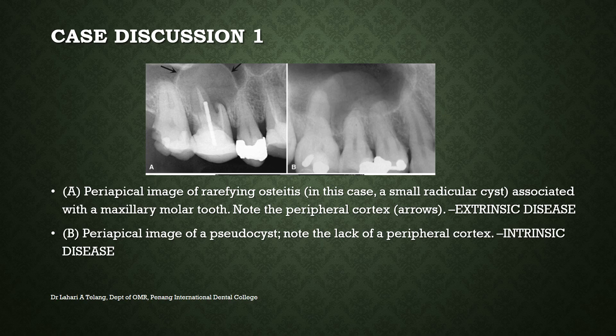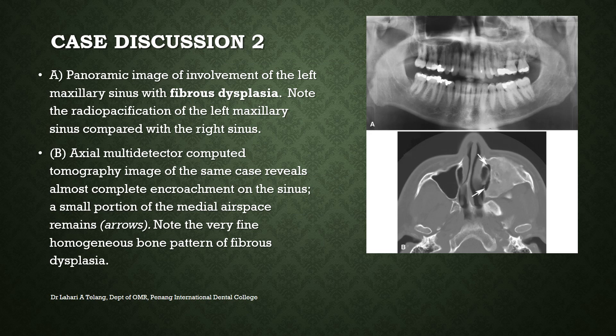This is a case of extrinsic involvement of the maxillary sinus by fibrous dysplasia. Image A shows the left maxillary sinus with a mixed radio-opacity and radiolucency, while the right sinus appears reasonably well-defined. The axial multi-detector CT images show almost complete encroachment of the sinus on one side, with only a small portion of the medial space remaining. The radio-opacification is homogeneous and consistent with the pattern of fibrous dysplasia.